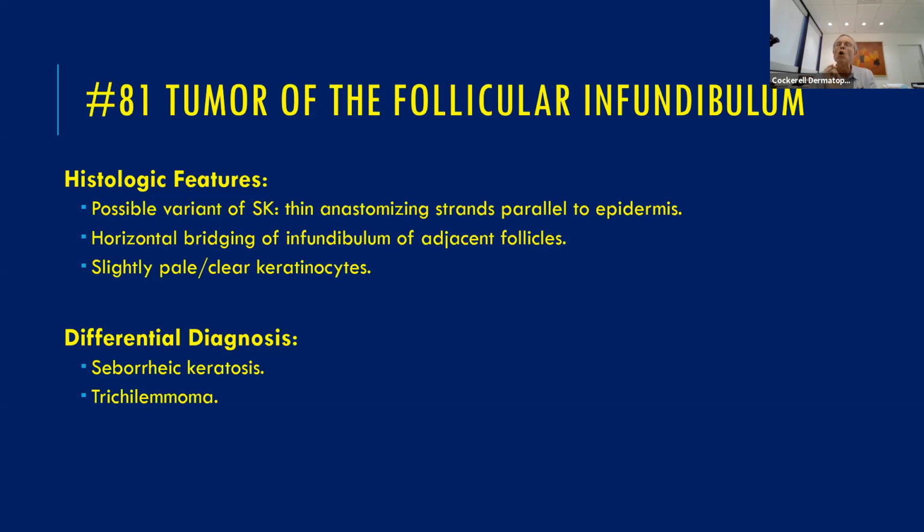They're probably low-grade basal cells. They tend to behave less aggressively than a basal cell. But because of that stroma, they're not mushy like a typical basal. So if you're going to treat those, you really need to excise them because it does have a different type of stroma than a classic basal cell.